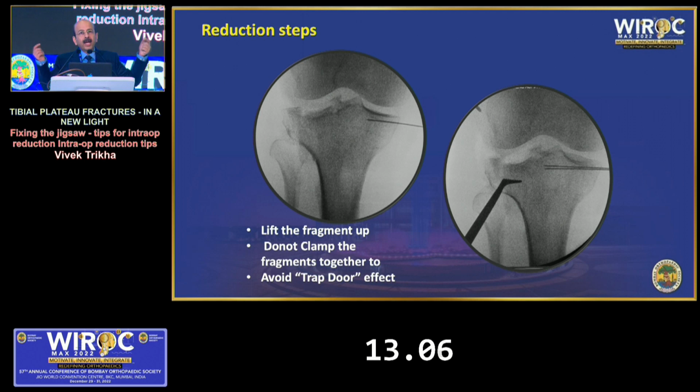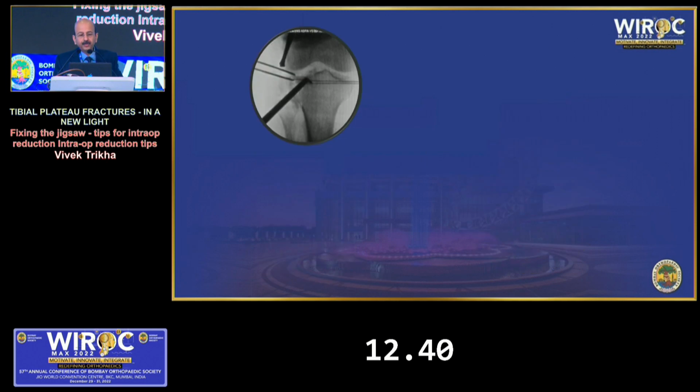Do not clamp before you lift up this depression. That's the first tip which I would like for the youngsters out here. Do not clamp before you lift up, because if you clamp before, the space for that depressed fragment is not going to come up. It will always remain down. That's the trapdoor effect which happens if you clamp it before. So lift up your fragment and then clamp to ensure that your depression is anatomically reduced.